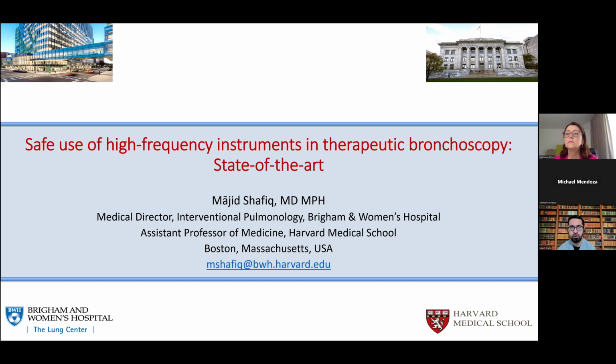If it is in the proximal or mid trachea and it's not particularly vascular, or only moderately vascular, I might do a rigid coring as well with the bevel. And then keep my APC at the ready: make sure the patient's grounded, make sure my probe's out, make sure my pedals are within reach, and my APC settings are ready to go. Because after mechanical debulking, often you're going to need APC for hemostasis, right?